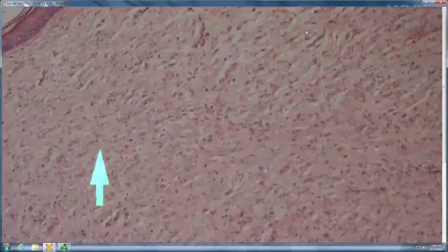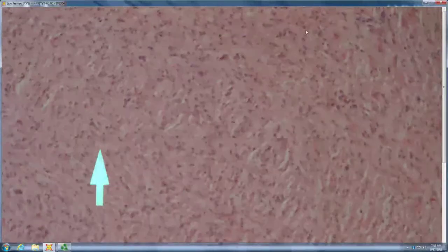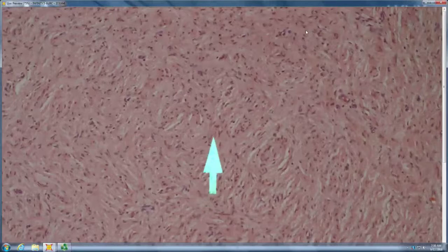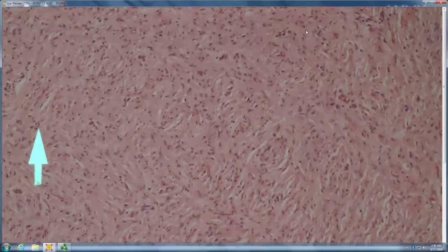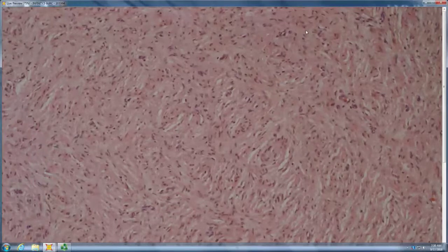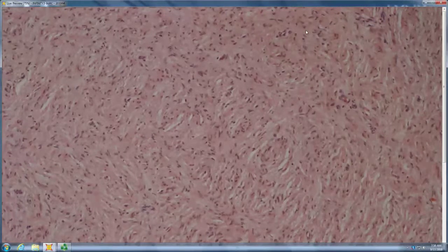Big nodule. Let's see. Fascicles of cells that are fusiform, some might say spindled, and they're absolutely straight? No, kind of wavy. Making you think of loose, uniform, kind of gray, myxoid. There are round mast cells all through it, and then the wavy spindle cells, jumping dolphins, neurofibroma. Neurofibroma, you are correct.